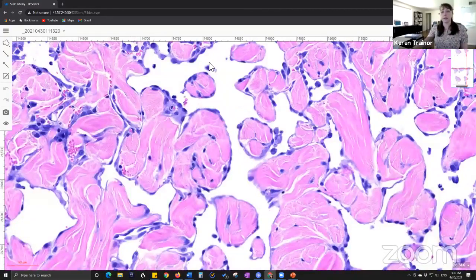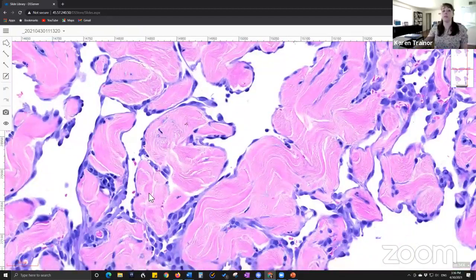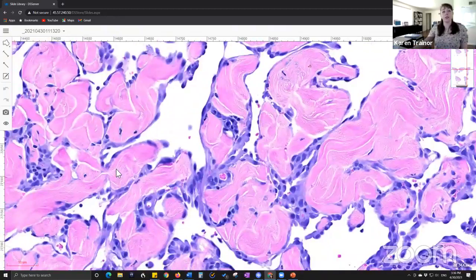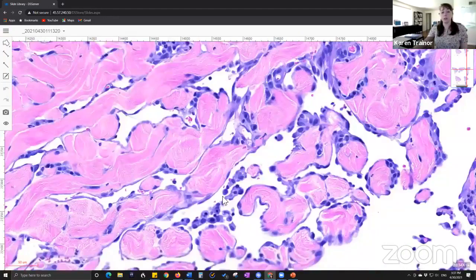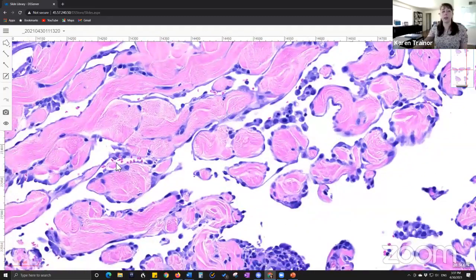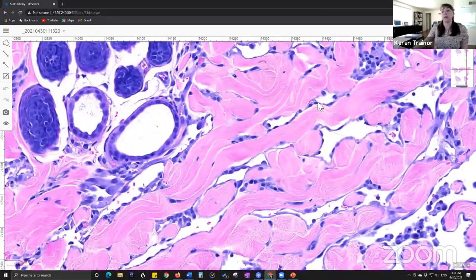What to make of that? Typically, when we see very low numbers of erythrocytes and clear, somewhat vascular channels, we start thinking lymphatics. So lymphangiomatosis, lymphangioma, lymphangiosarcoma start to become differentials. But cats are very special, very unique. They do their own thing.